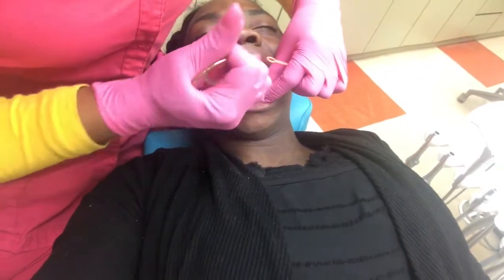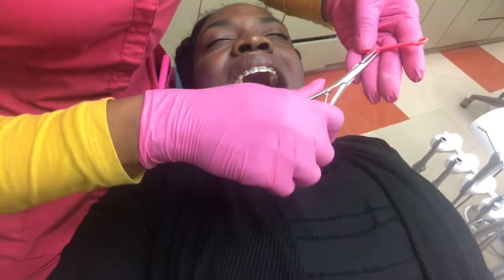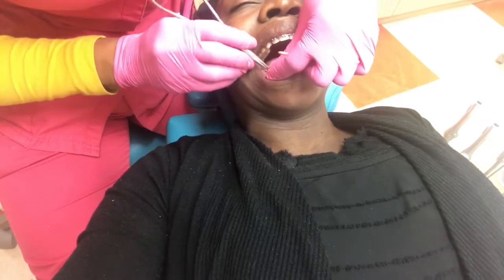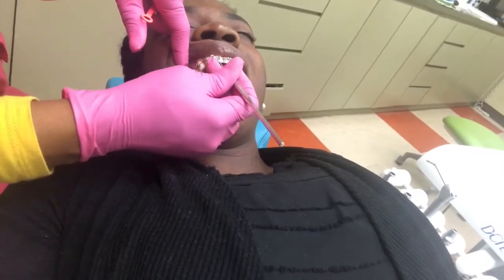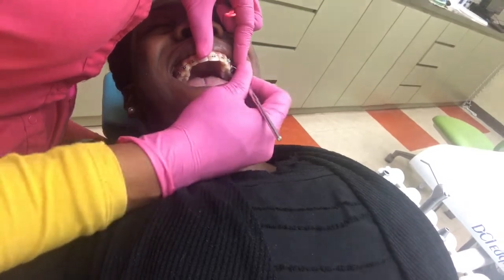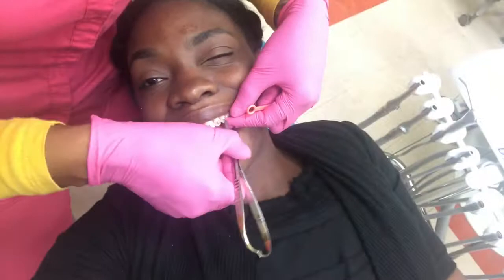This one definitely worked out because I have it in right now as I'm recording this. At this dentist visit I'm pretty much just doing an adjustment. With adjustments they sometimes change your wires, cut off the excess pieces, remove your old elastics and put in new ones. At this appointment I had my coral elastics put in. This entire process usually takes about 15 to 20 minutes. I will also show you what the tongue crib looks like inside and outside of my mouth.